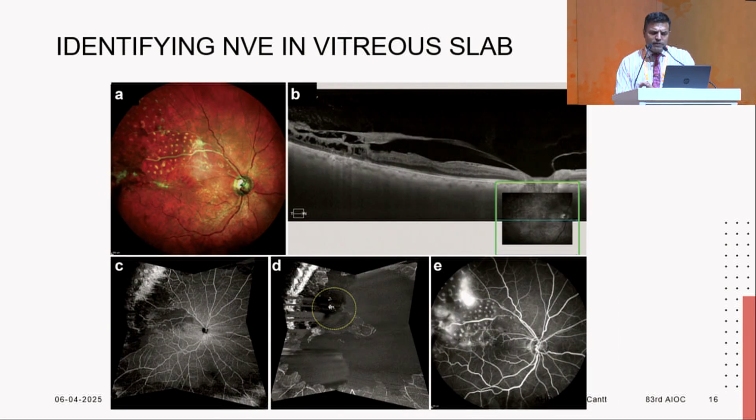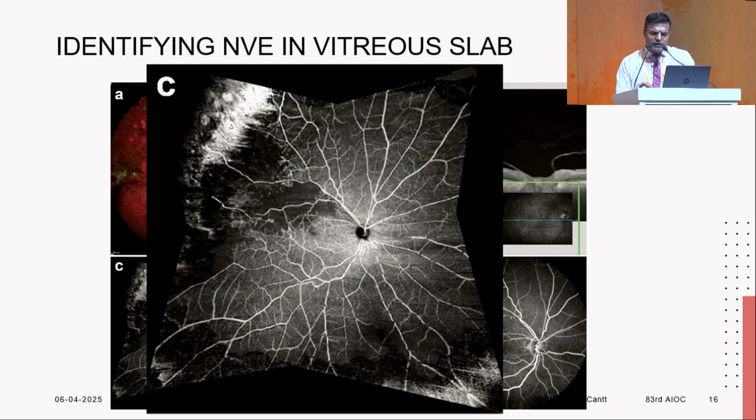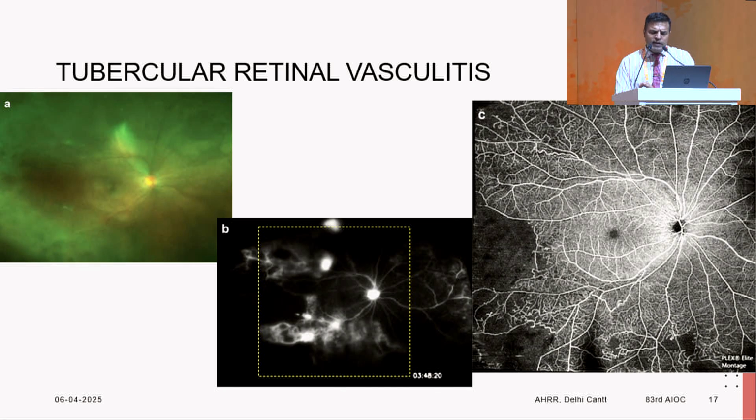Similarly, we have been identifying neovascularization elsewhere in such cases, directing our therapy to the CNP areas. And in cases of retinal vasculitis, in one such case of tubercular retinal vasculitis, where we realize that now the disease activity is progressing toward the macula, it becomes clinically a sight-threatening disease, and the immunosuppression in such cases can be escalated from routine steroids to immunosuppressants and probably biologicals like adalimumab.